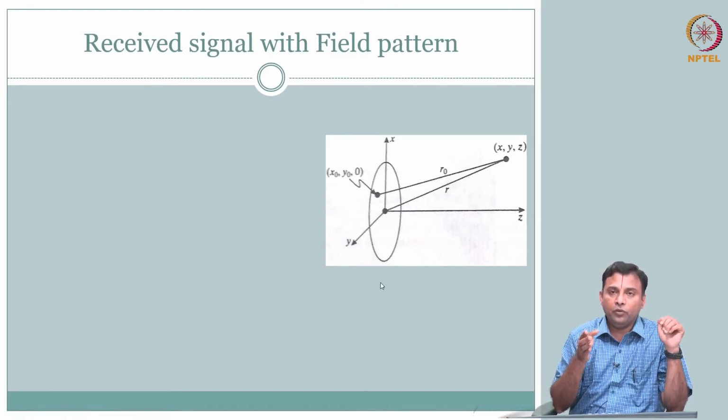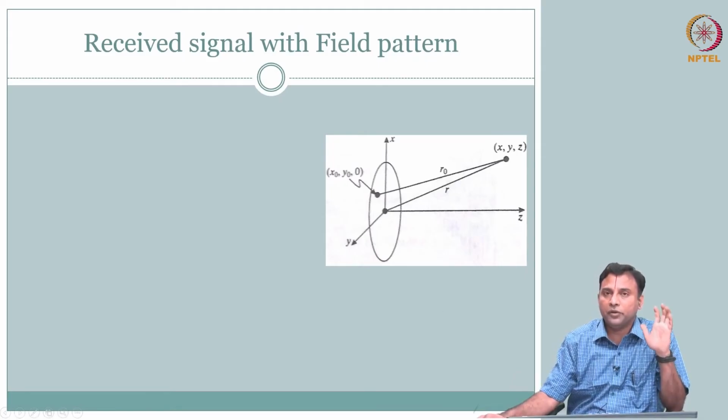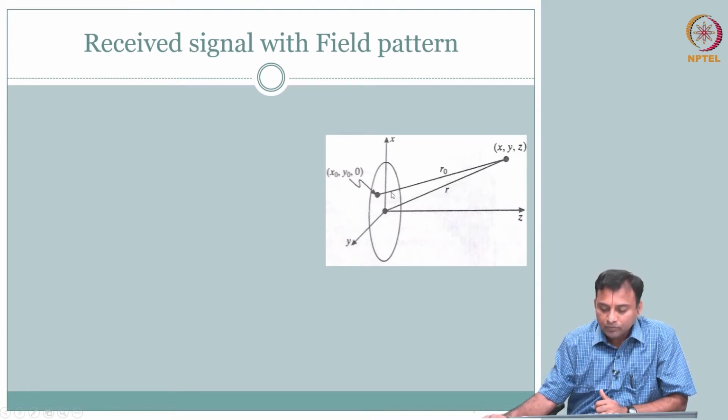If you use a particular shape and size and excite it with the resonant frequency F0 as a pulse that we saw, what is going to be the pressure field in front of the transducer? That is what we are going to see. So, we take a shape. For simplicity, it is a circle here, but it can essentially be generalized to any geometry.